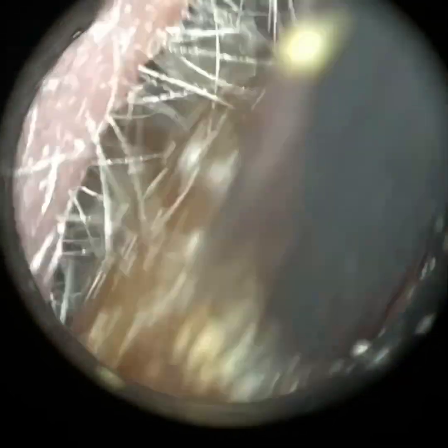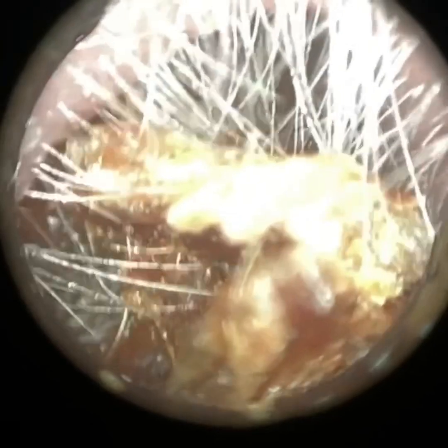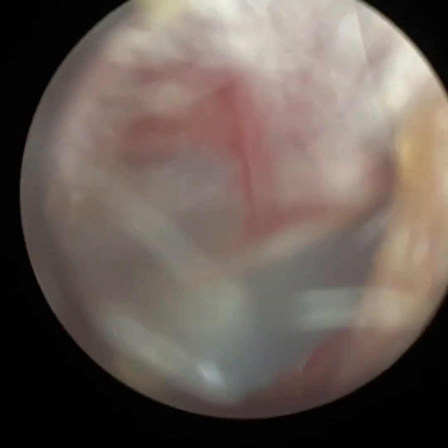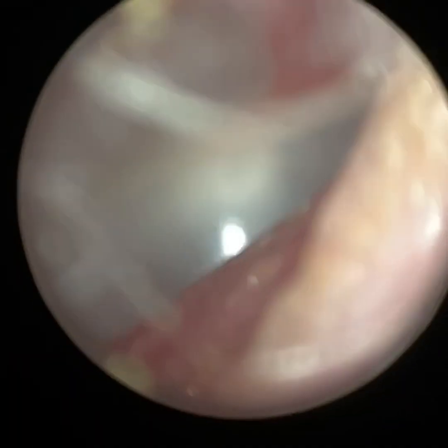You can see I just used the suction again just to lift it off the floor. I'm just going to the back part of the ear canal here and bringing this down. It's beginning to separate into smaller pieces now. Just giving it a little wriggle — we're just in that region between the first and second bend. What the wriggling motion does is not only help to squeeze the wax plug out, but if there are any skin adhesions around the periphery of the wax plug, it helps to separate it from the canal wall. So that's the patient's eardrum.